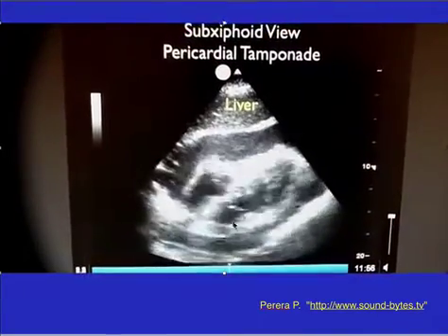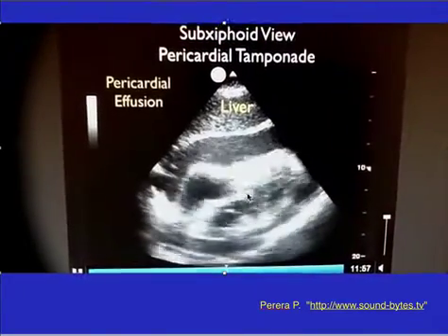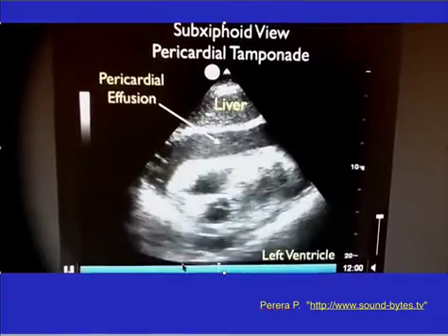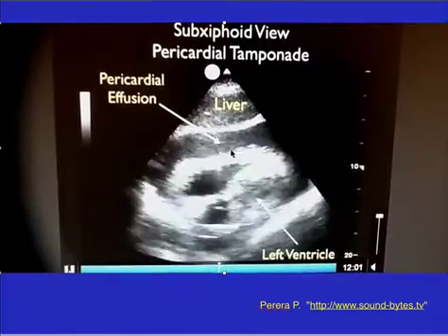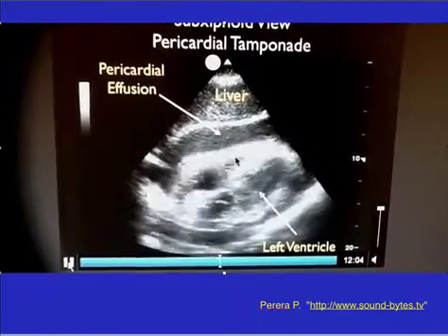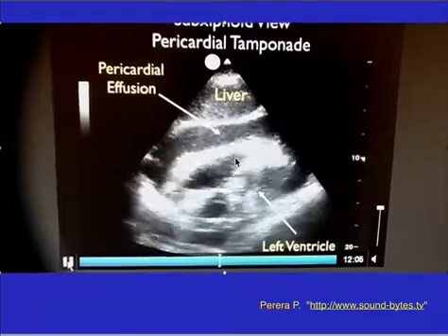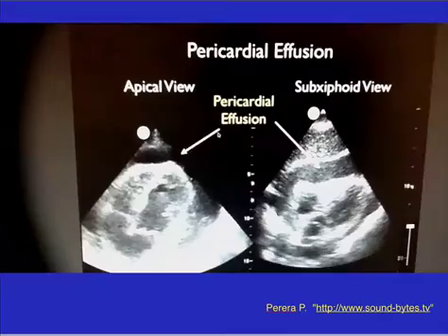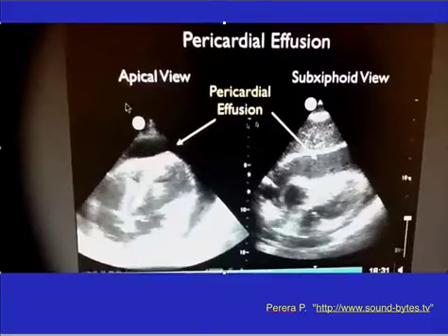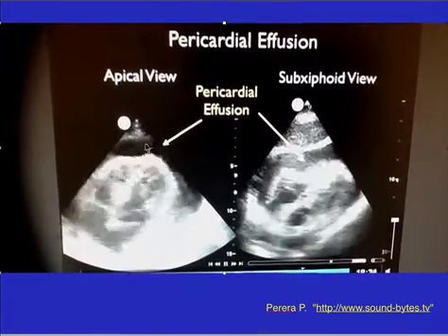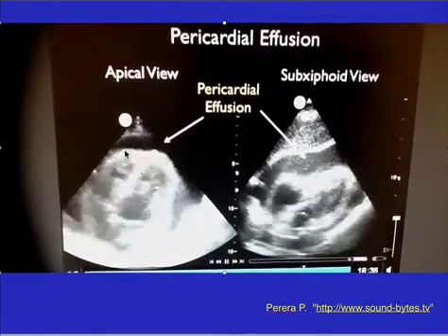Here it is in actual play. You can see the liver, the pericardial effusion, and the ventricle collapsing and sometimes opening up. This shows both an apical view and a subcostal view — you can see the pericardial effusion in both.